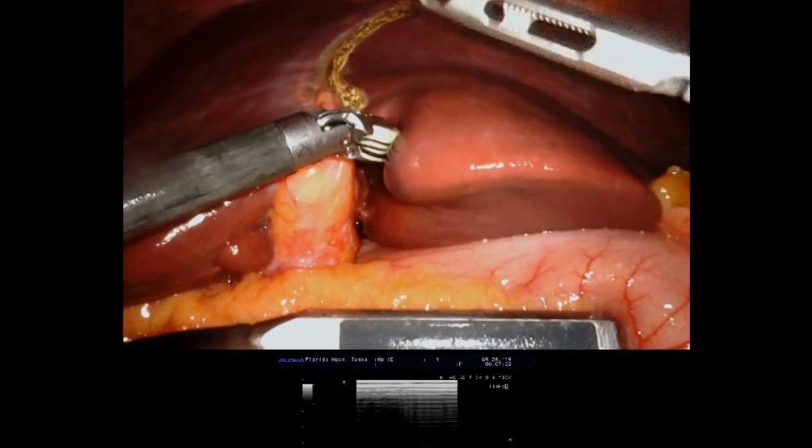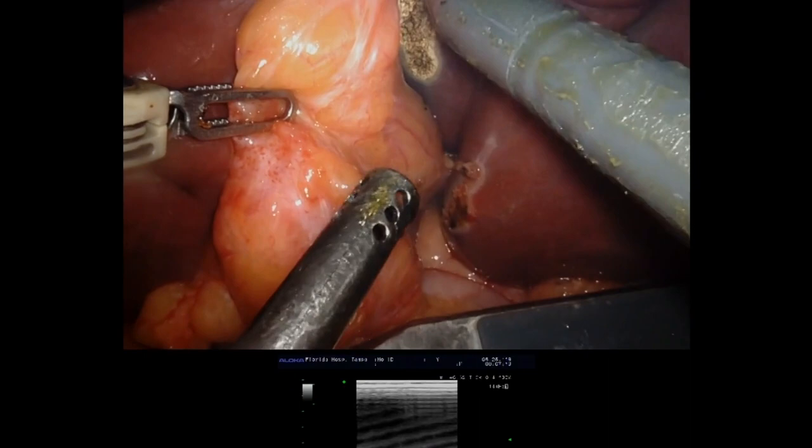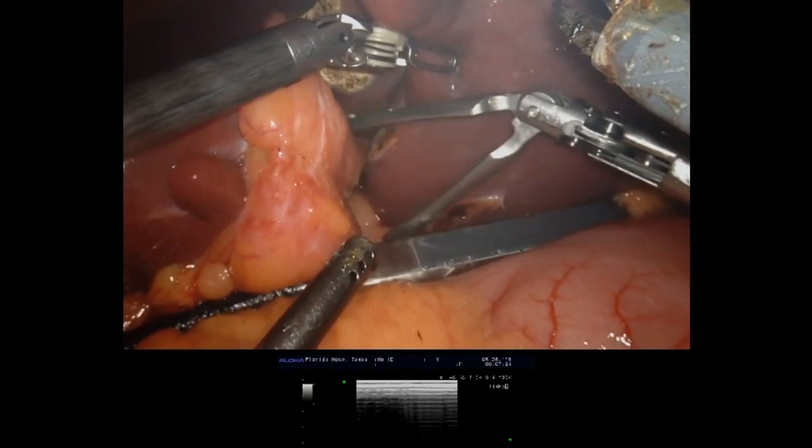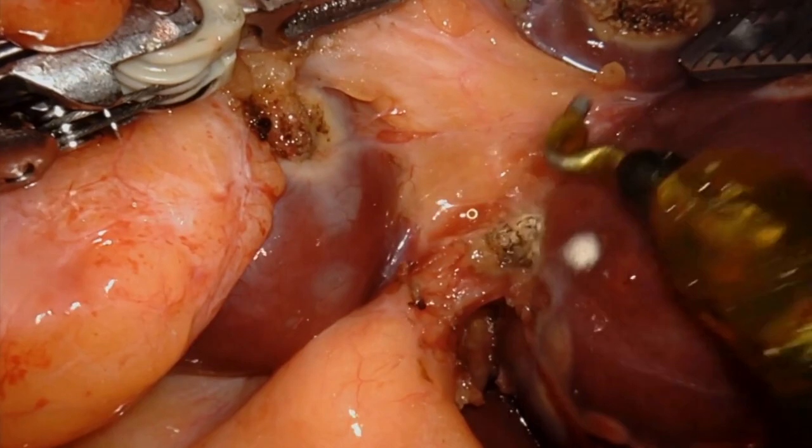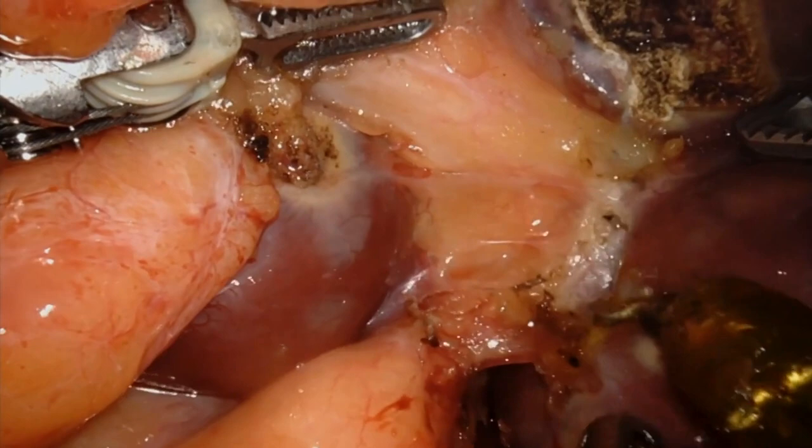The base of the umbilical vein was exposed with lateral traction of the future remnant and medial traction of the left lateral section. We are now entering the base of the umbilical vein for inflow vascular control to minimize bleeding during this operation. The hook cautery is very useful to dissect the left portal vein branches going to segment 3 and segment 2.